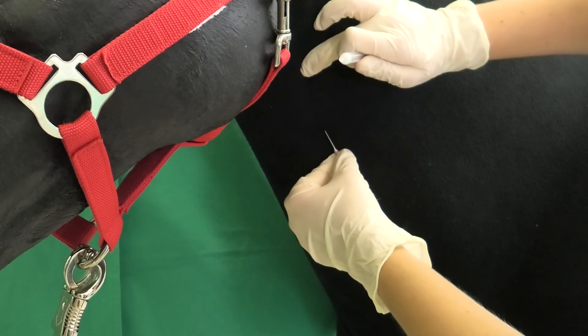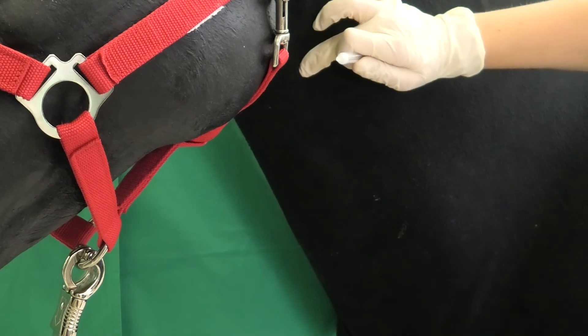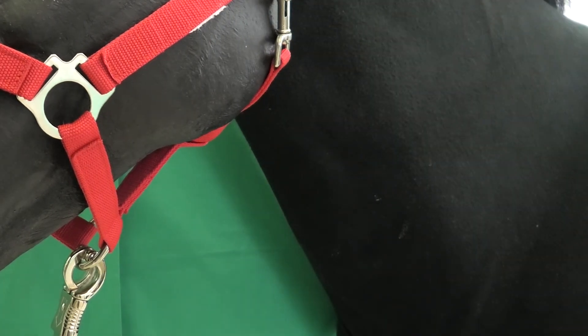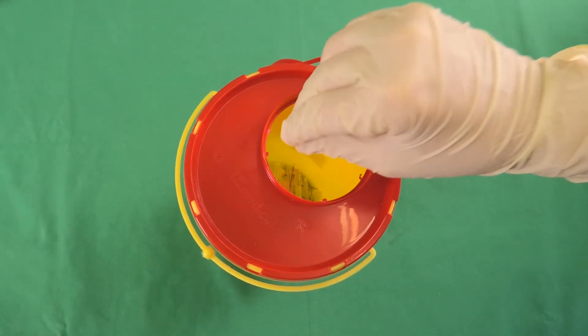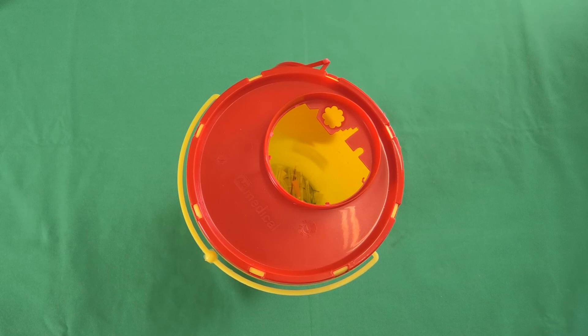The cannula is now withdrawn from the vein. After letting the congestion go, it should be ensured that there is no secondary bleeding. The injection site should not be touched afterwards. The cannula is now disposed of in the appropriate container. The syringe is disposed of with residual waste.